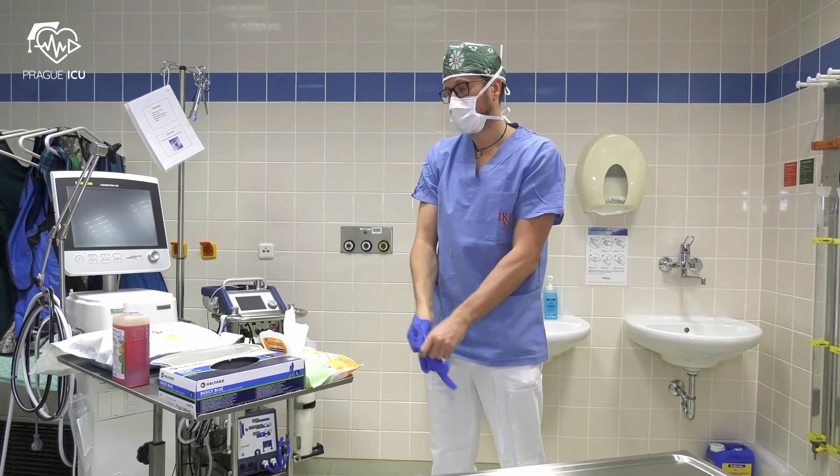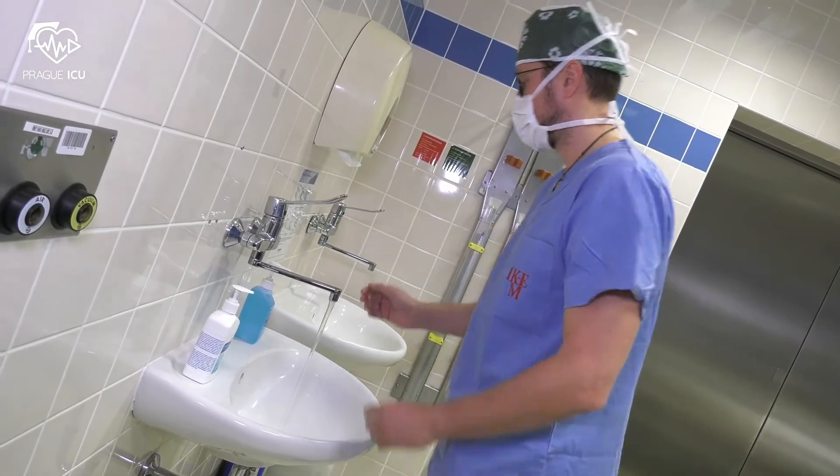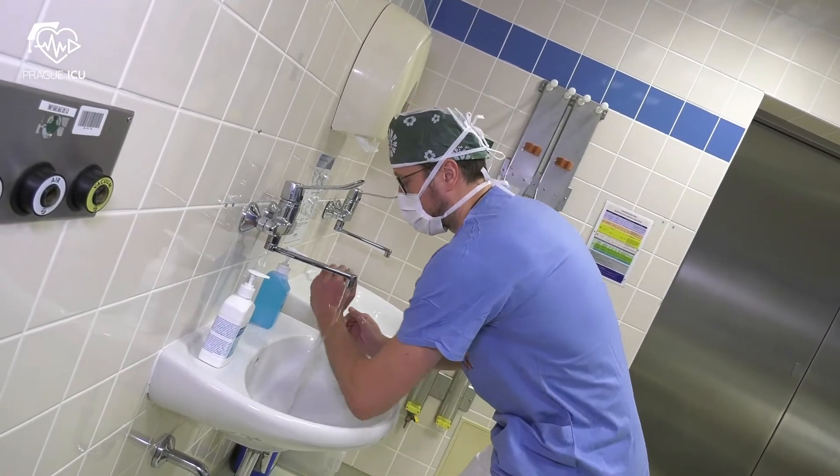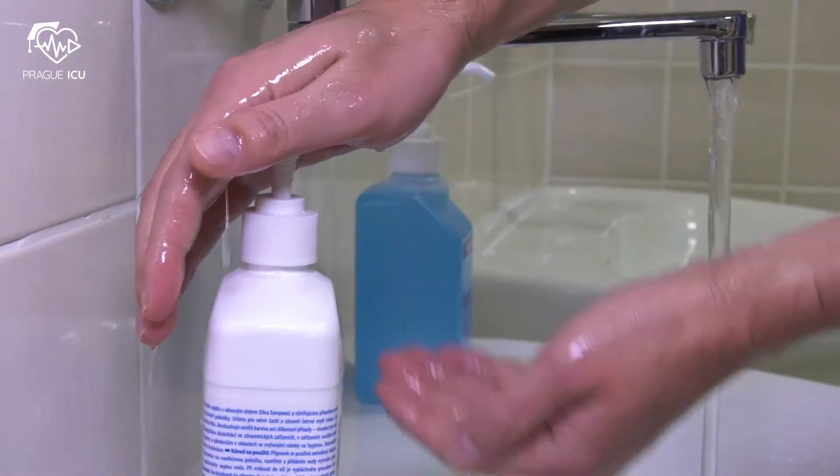Remove the gloves and discard them. Now we proceed to hand washing. First of all, moisten your hands with water. Hands need to be kept upright and bent to the elbows, allowing water to drain away.